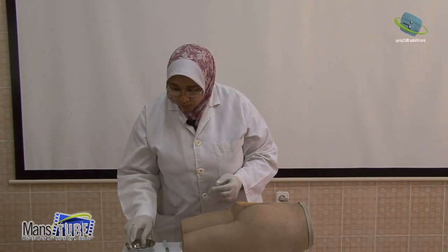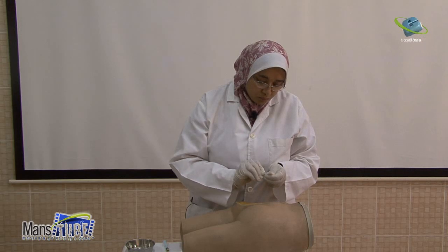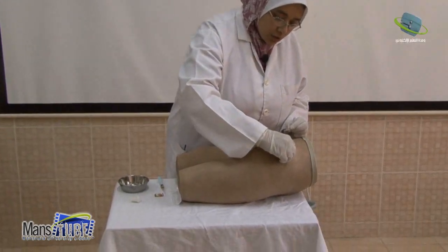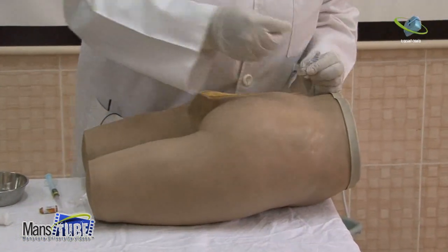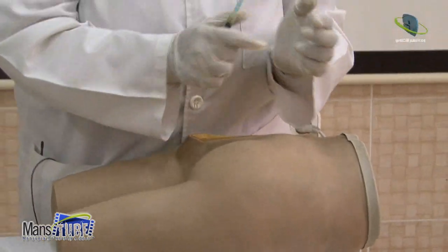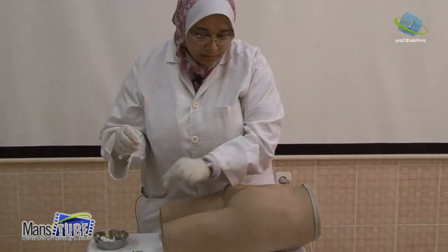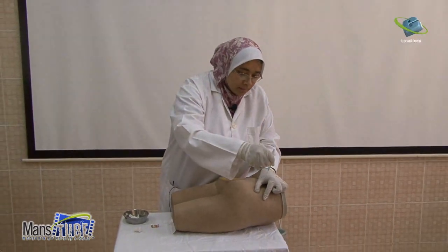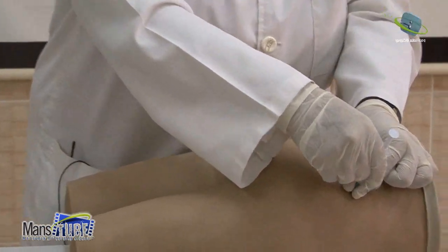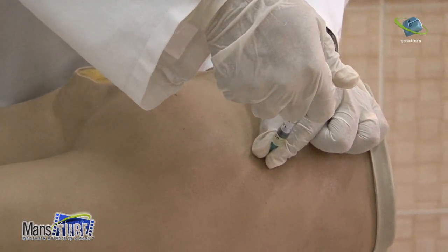After determining the upper outer quadrant, clean it with an alcohol swab from the center outward in a circular motion in one direction. After disinfecting, hold the dry cotton sponge in the fingers and stretch the skin. The needle angle will be 90 degrees. Avoid superficial blood vessels when puncturing the skin. Aspirate — there must be no blood. If no blood, inject slowly.